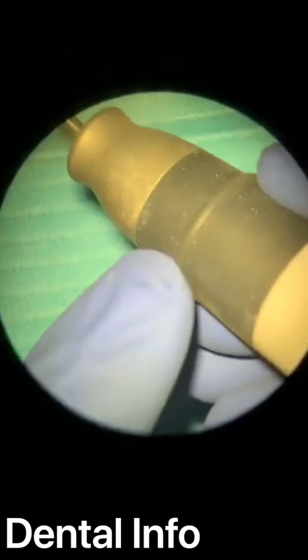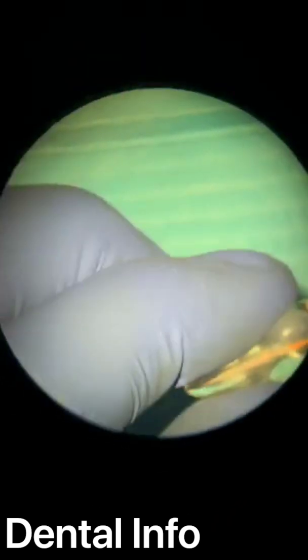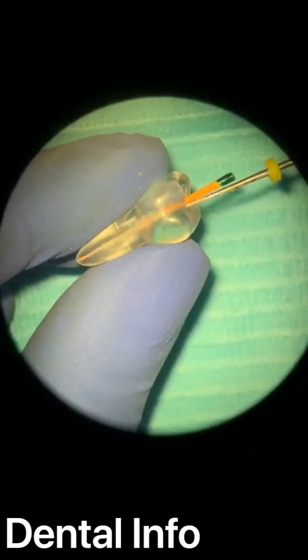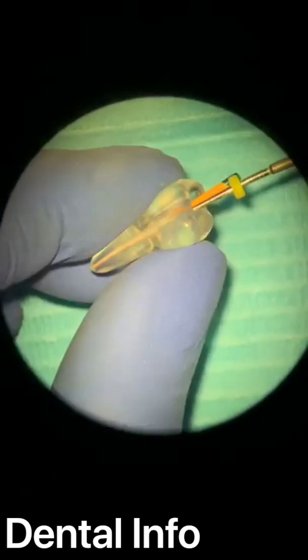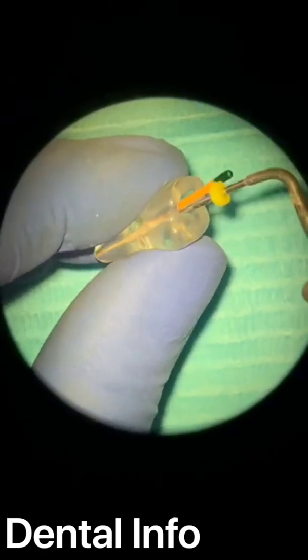So this function is very nice. This counter is very nice. You know that if you exceed 5 seconds, the recommended time for cutting, the device will do it on your behalf. Okay, so I will put the tip here, and I will activate, and I will go down in less than 5 seconds. Let's see.